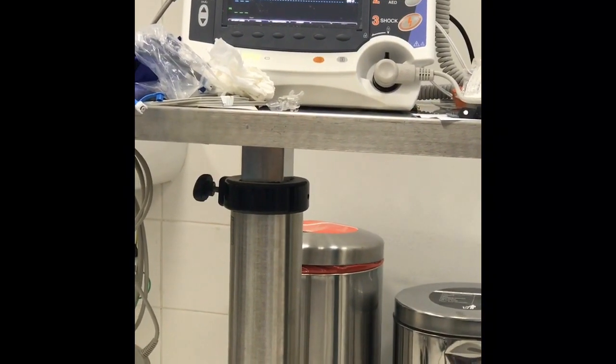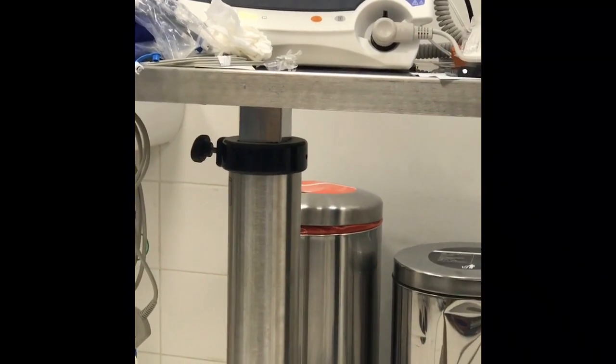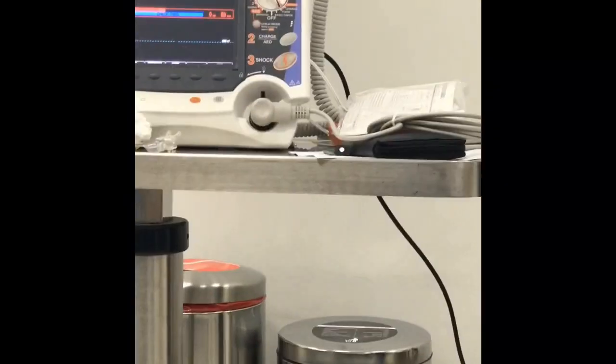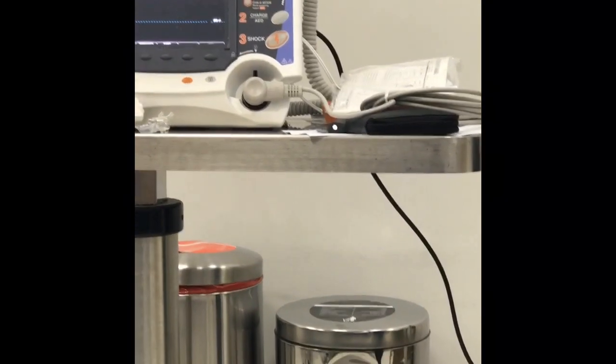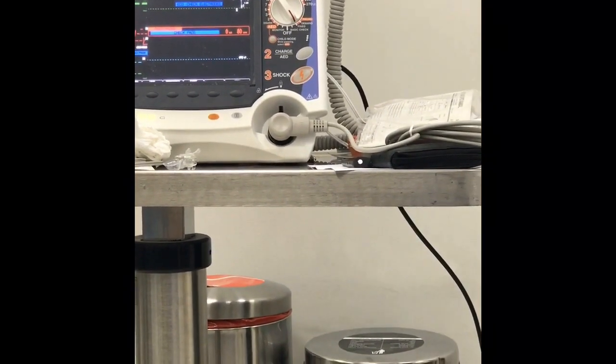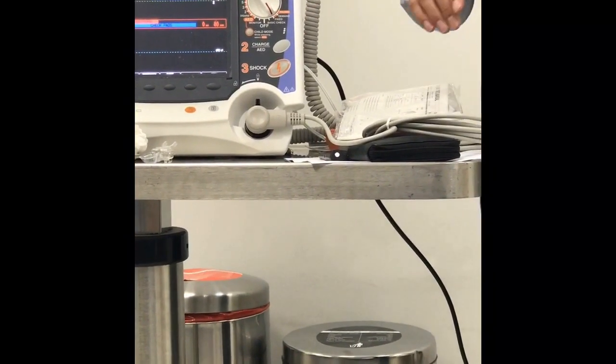But we have two modes: fixed and demand, as for all defibrillators. And from here you can assign the pacing rate. See here, the pacing rate. And from here you can assign the output current for pacing in milliampere.